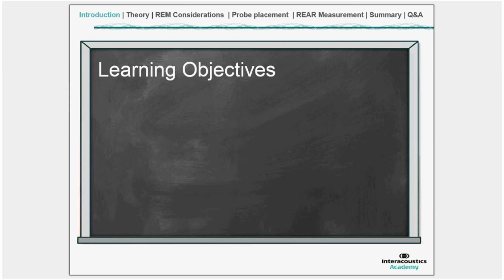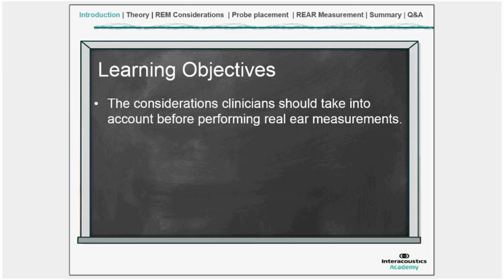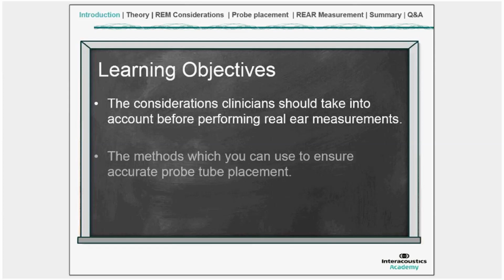So, with respect to today's webinar, let's quickly go over the learning objectives. Firstly, what I want to do is to make you aware of the considerations that clinicians should take into account before performing REM measurements. These considerations actually only take a very short amount of time, but they are quite important to make sure you've covered in order to get the best results from the REM measurement.